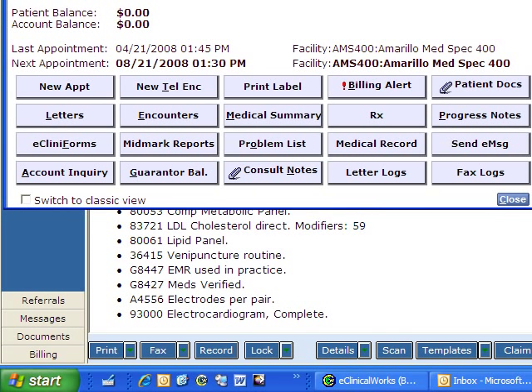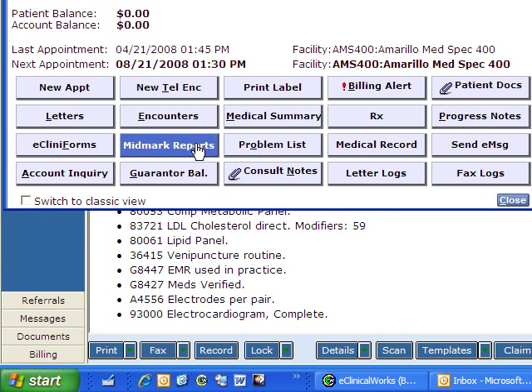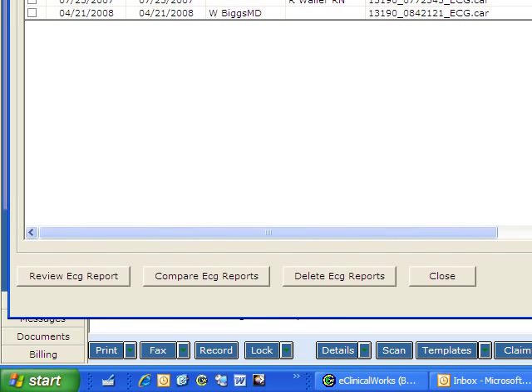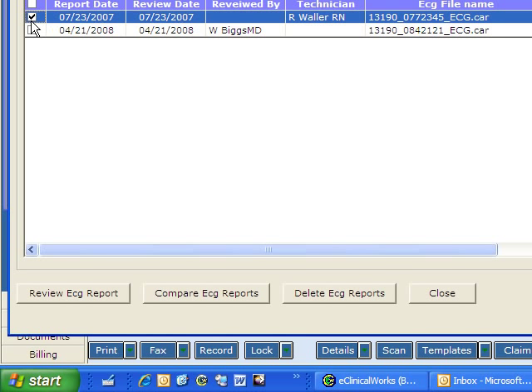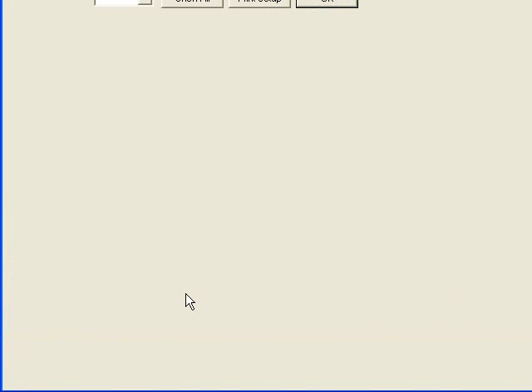Let's look at the Midmark reports on the patient hub. Right there. Click on it. We'll drag this down into our window and you'll see that I've previously run an EKG on this patient. So let's compare the two of them.